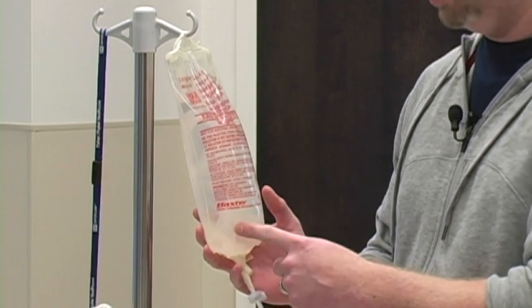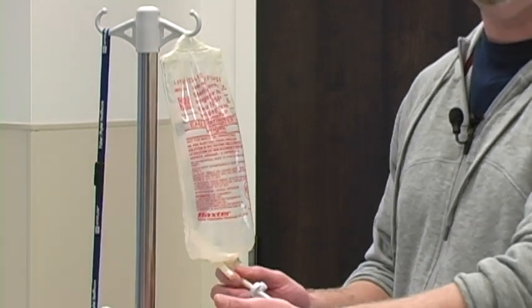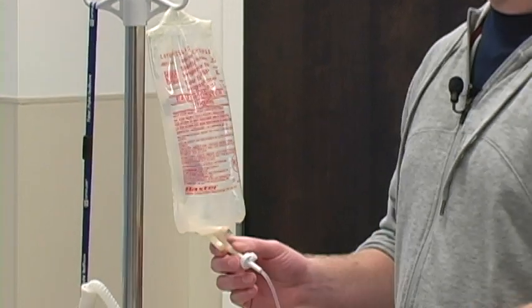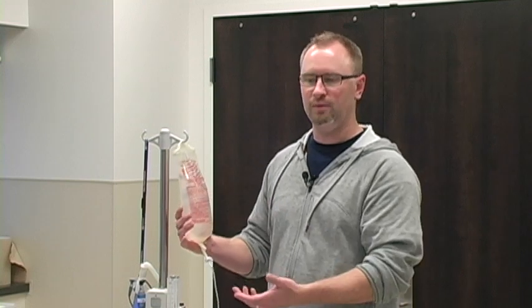If it is getting close to empty, you can either change it yourselves. It's a sterile water bag, which respiratory will bring up and put at the patient's bedside, and you just spike it as in any IV bag. Or you can page respiratory and we'll come up and do it for you. Right now we've got a 1 liter bag hanging. For those units that purchase their own Optiflow, it's likely that you'll see a 2 liter bag that's specifically for Optiflow. So it's quite a different looking bag, much bigger.